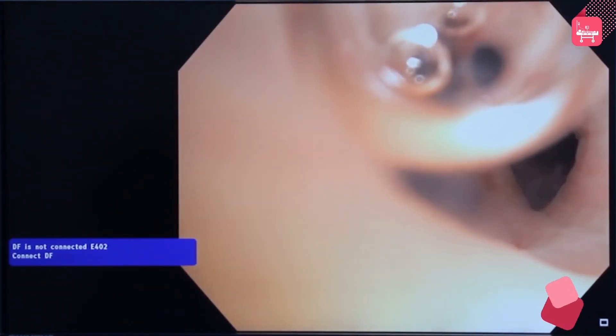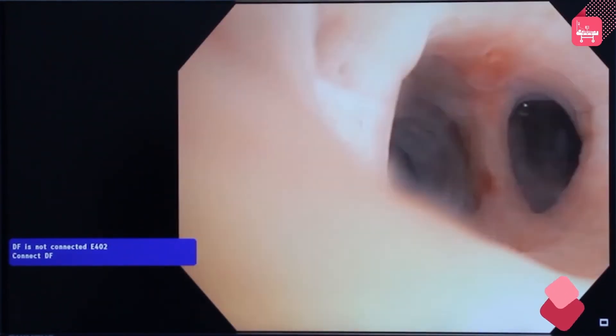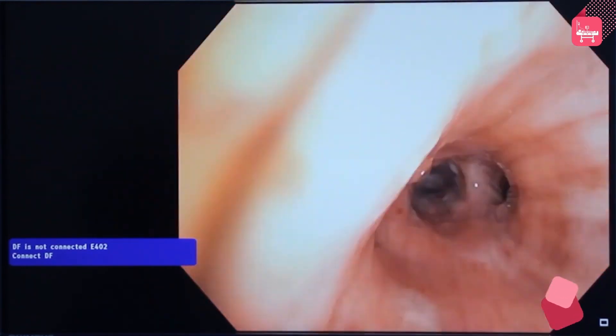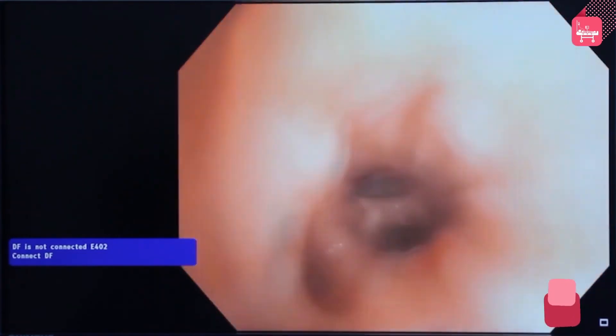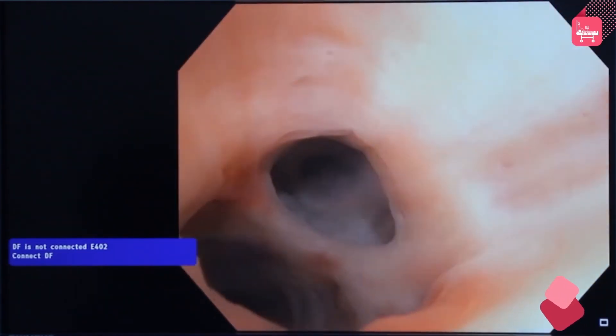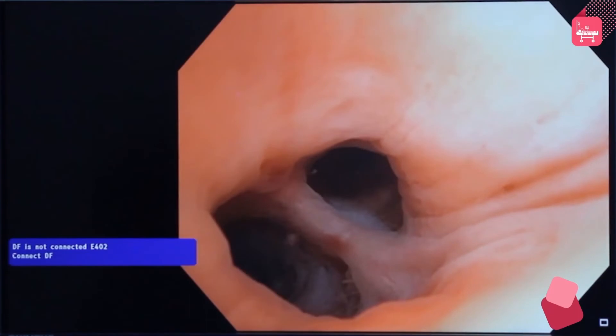Perform bronchoscopy for both therapeutic and diagnostic indications. Once the procedure is complete, slowly come out of the bronchus, check for any active bleeding, and make sure that the airways are clear. Suction the secretions so that they will help in diagnosing the problem. Slowly bring the bronchoscope out of the tracheostomy tube.